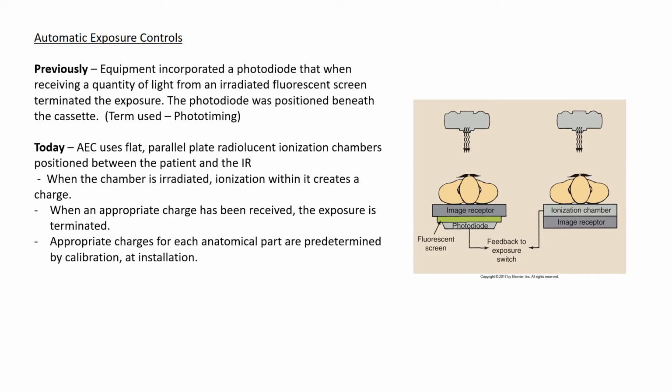So at the time of installation, the technician who is installing the equipment is going to use phantoms, take images, and show the radiologist or quality control tech, what do you think about these images? They're going to say, yep, they either look good or they don't look good. If they look good, however, an amount of exposure was necessary to produce that image, that would be the amount of exposure that would be then calibrated into the chamber so that you could terminate the exposure.